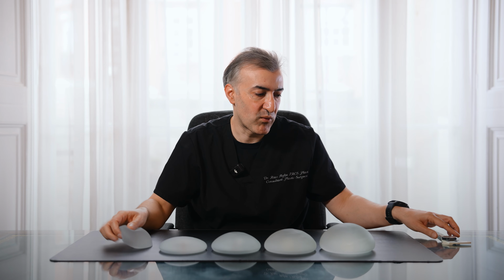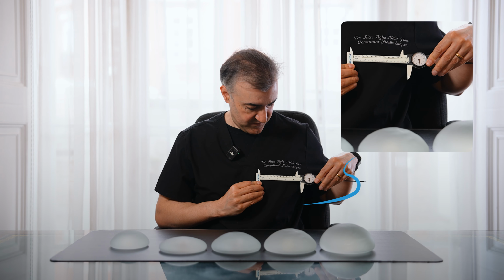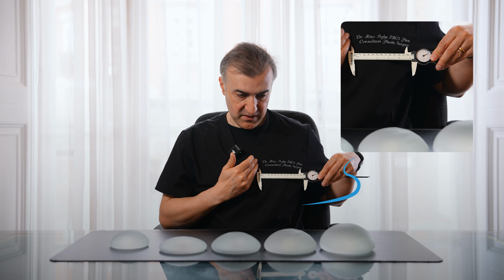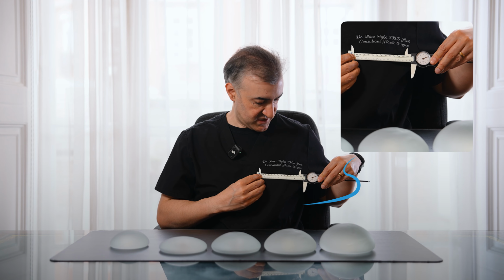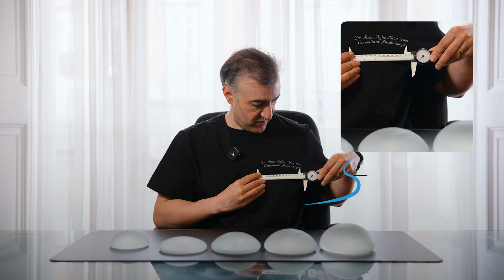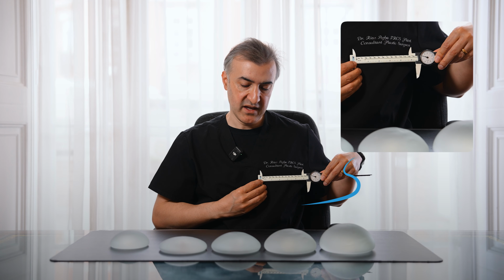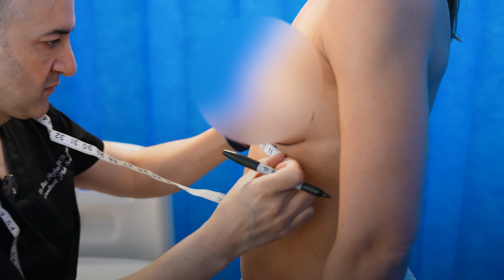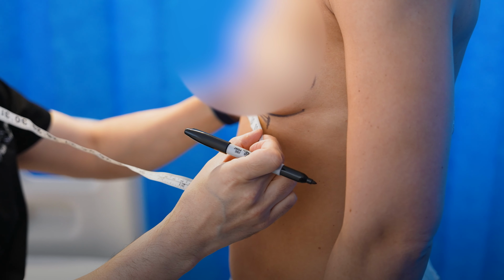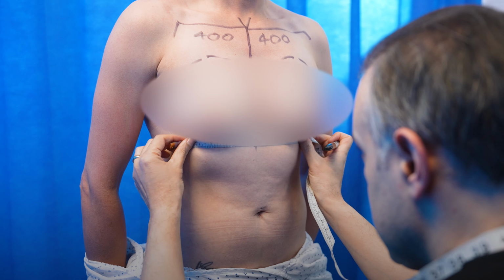So one of the things that we do when we're sizing patients is we actually measure the chest. So we will measure, okay, there's the inner aspect of the chest, and then where does the outer boundary of the chest go to? For example, that may be about 12 centimeters you might measure. And so you want to have your breast implant to be about 1 centimeter, usually, less than what the limits are. Now you vary that.